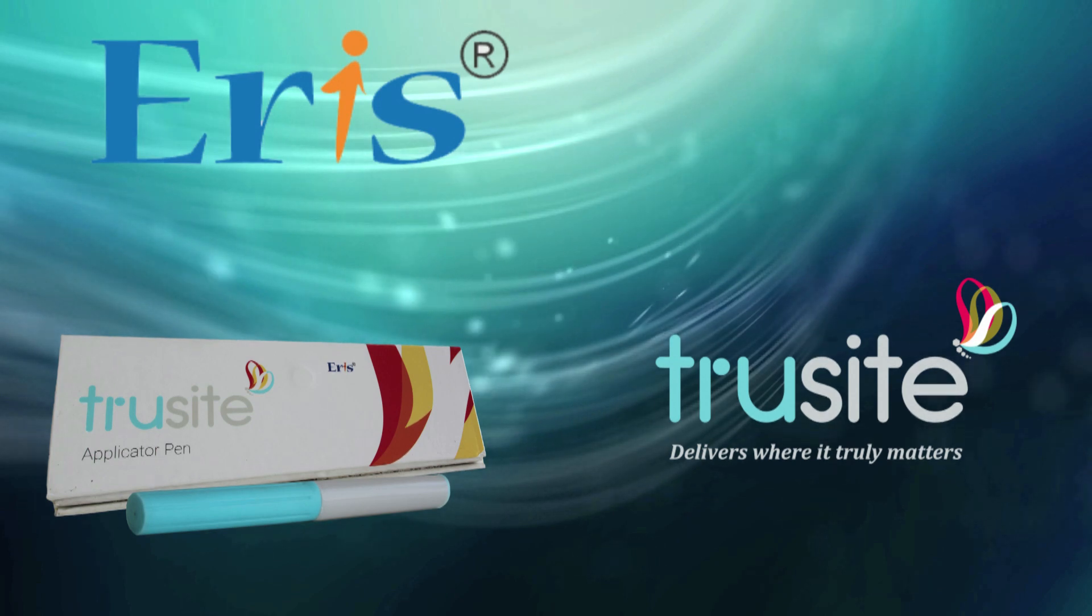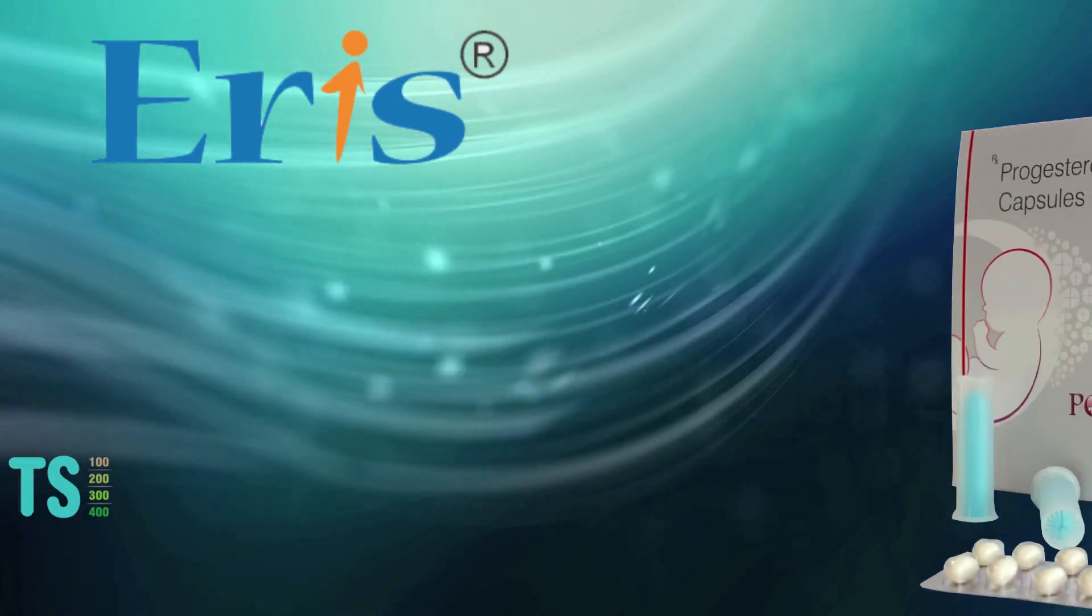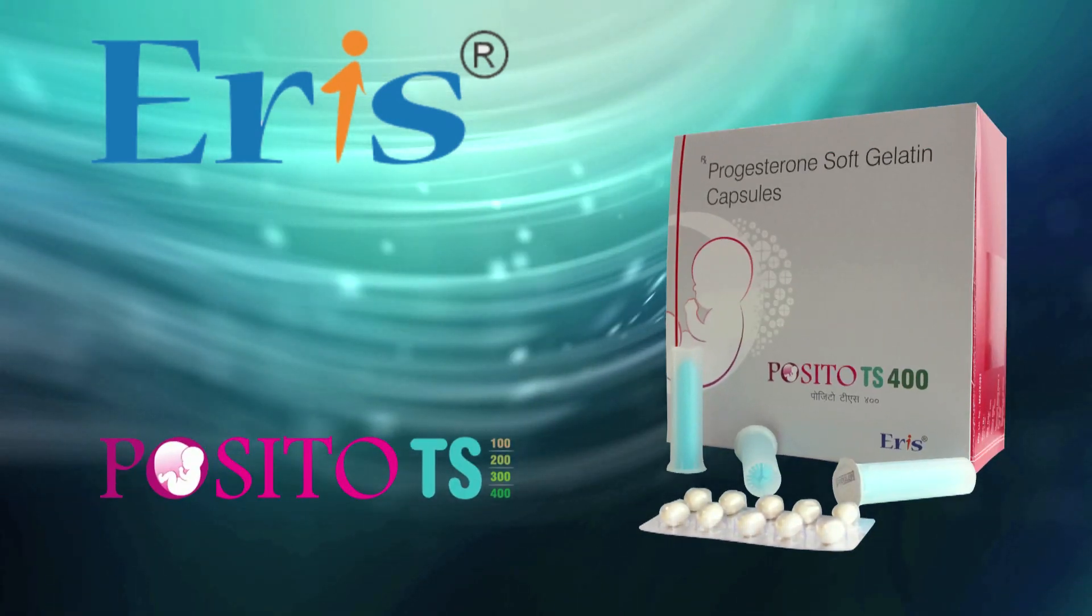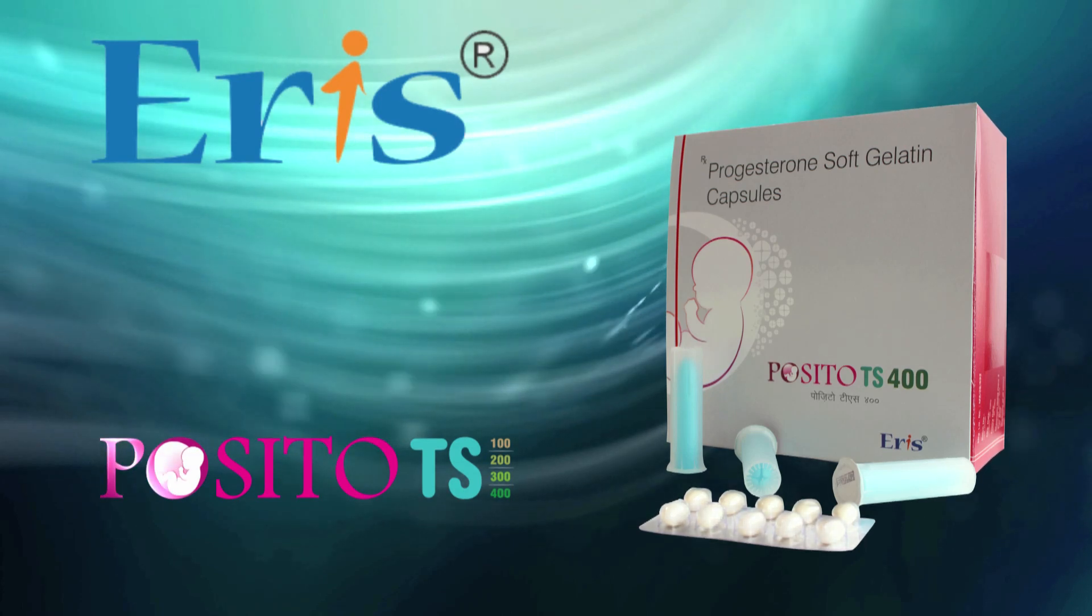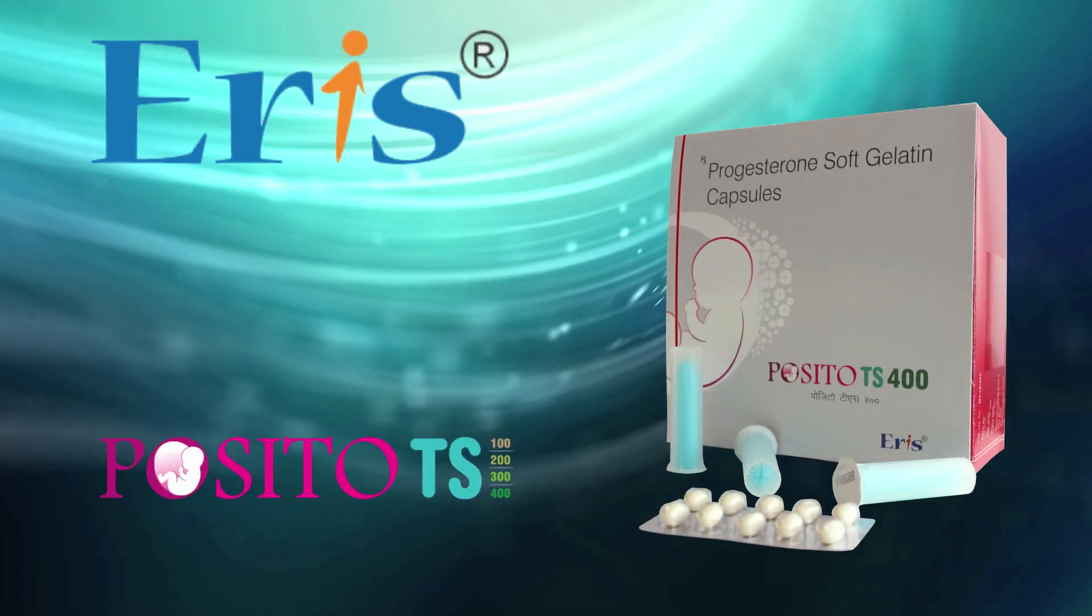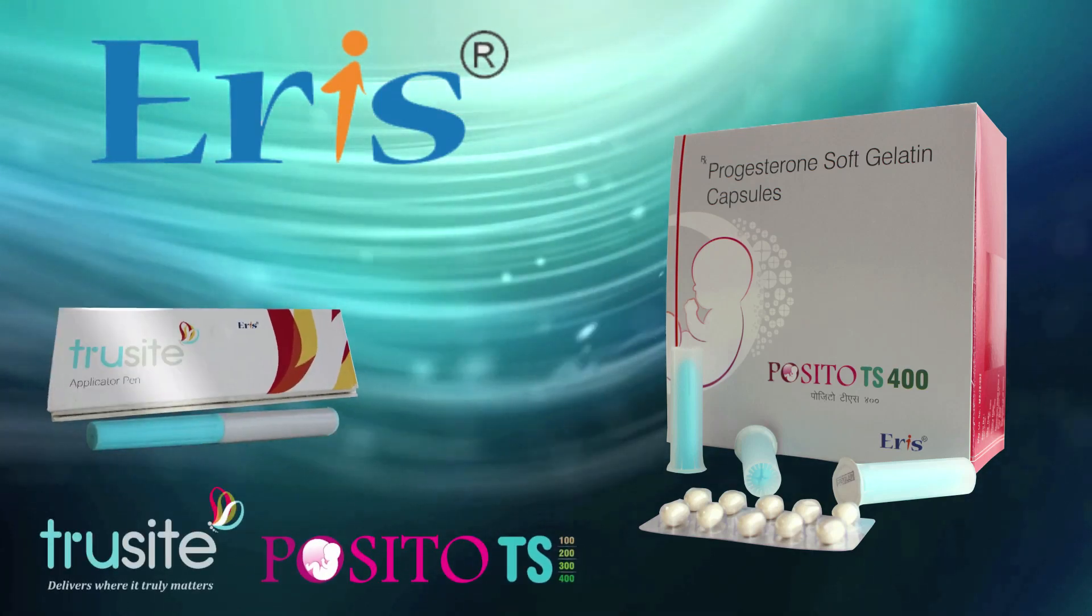Trusite applicator is India's first vaginal progesterone delivery system, as per global standards. The Trusite applicator and Posito TS kit contains 30 Posito TS soft gel capsules, 30 sterilized sealed cartridges, and 1 Trusite applicator.